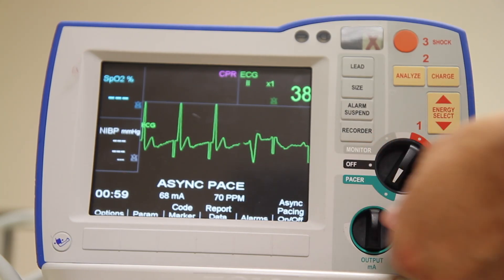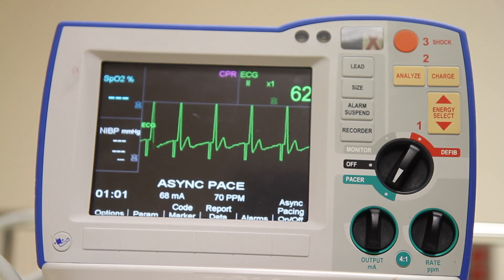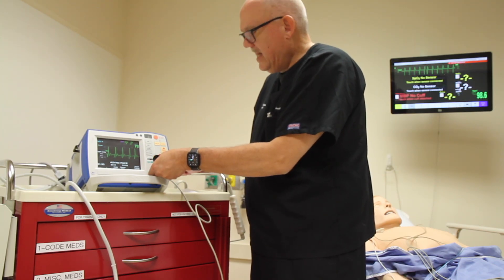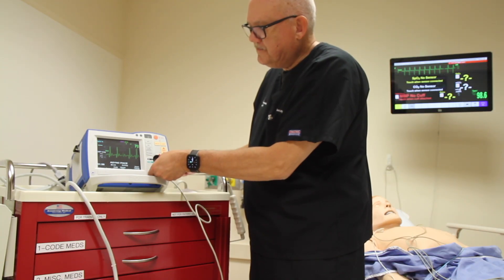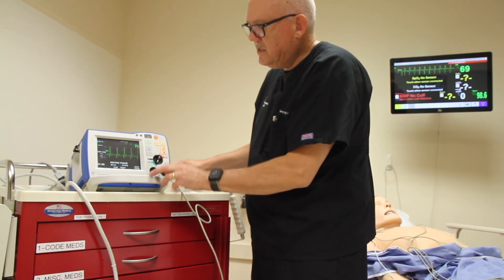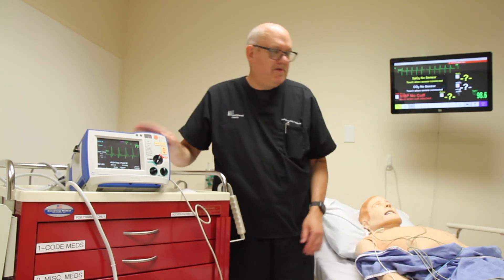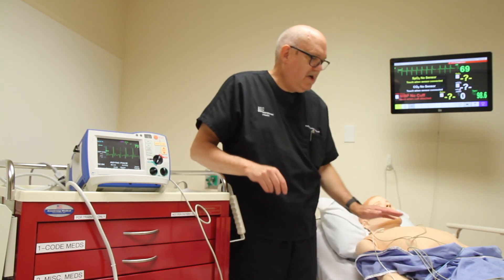The minimum output needed to achieve capture is called the patient's threshold. We're going to adjust the output 10% above this setting. Finally, we're going to confirm the effectiveness of pacing by checking the patient's pulse and blood pressure.